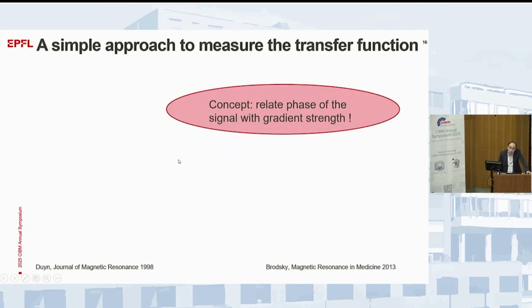However, when I was doing this type of work in our previous institutions, we didn't have access to such unique instrumentation. So in this way, we had a similar approach to measure the transfer function using standard hardware of the scanner and a phantom.